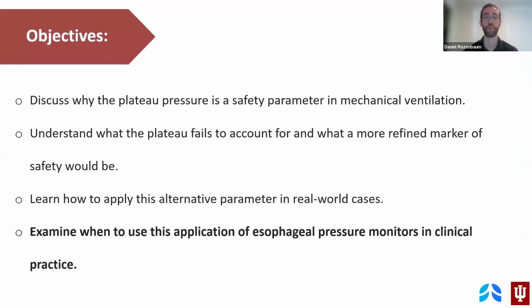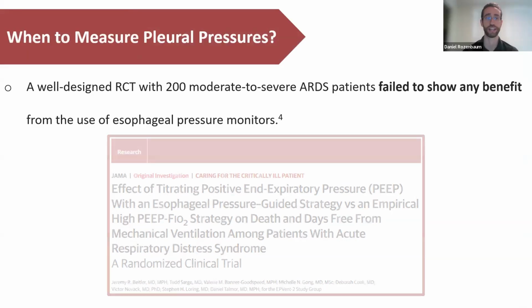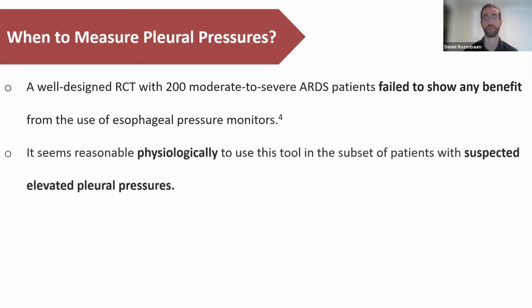Now, let's examine when we would use this application of esophageal pressure monitors in practice. Although a well-designed trial failed to show any benefit from the use of esophageal pressure monitors in patients with ARDS, it still seems reasonable physiologically to use this tool in the subset of patients with suspected elevated pleural pressures.